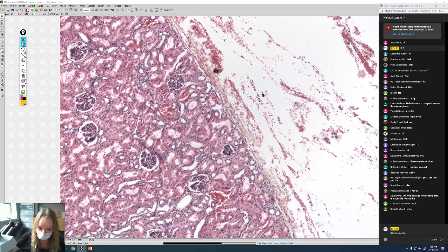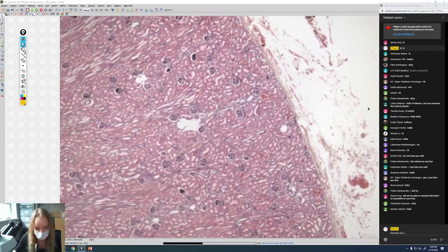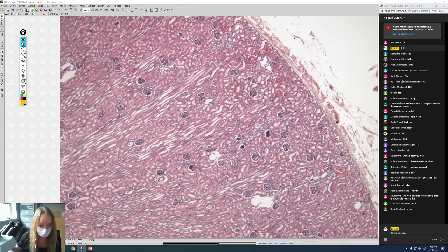Okay, but how are you going to distinguish medulla and cortex itself? So, the cortex, which is of course right under the capsule, contains something called, I don't know if it is the right word, the renal bodies. Corpuscles. Renal corpuscles, maybe. How to write it? Yeah, renal corpuscles. Or renal bodies, I guess that's the right name.